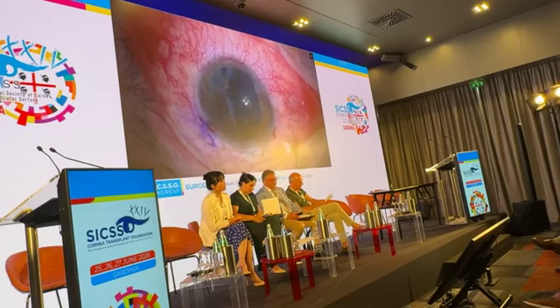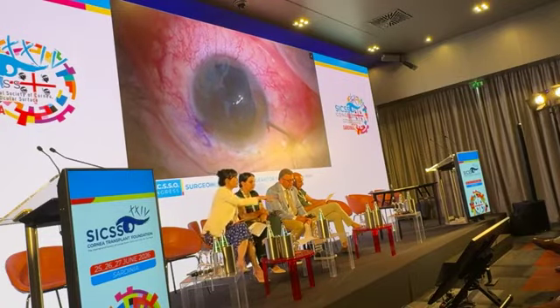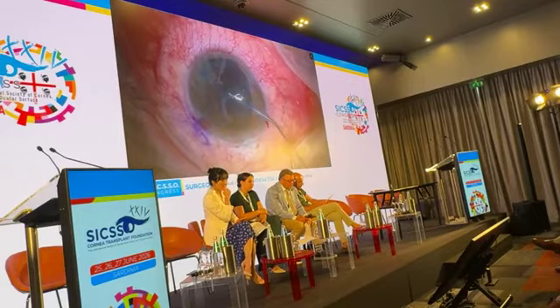Now he's preparing to inject air. For the air injection, he's using a 1 ml syringe just to control slowly the influx of air in the anterior chamber.